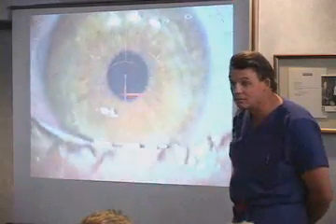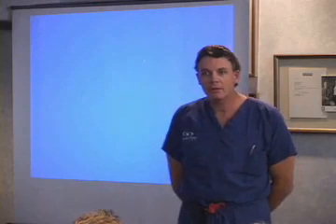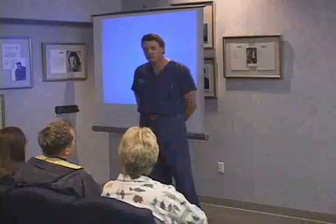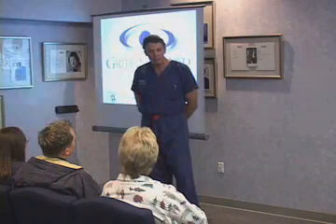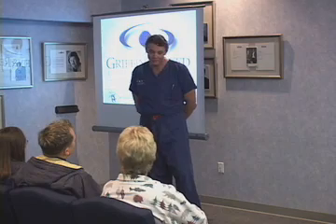And he's done. Okay? How much time did that take? The whole thing, well, the laser time was about 54 seconds, I think, in that eye. And it takes about 12 seconds to make the flap. And it takes about 10 years to figure out how to do it so he can see tomorrow. Okay?